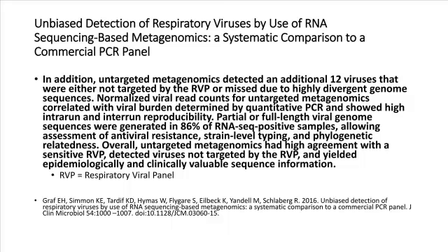So just briefly, what I wanted to point out on this slide is that metagenomics, RVP stands for Respiratory Viral Panel, are very good at finding everything that's in a sample. They have a very high agreement with a prior respiratory virus panel, so the respiratory virus panel are samples that may run individual or multiplex PCRs. And again, the information you get back is pretty thorough and identifies a lot more than we have identified to date.